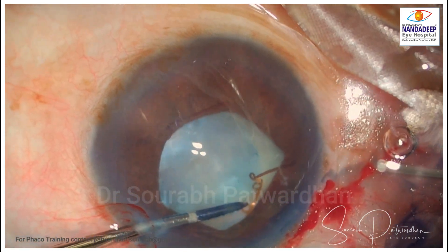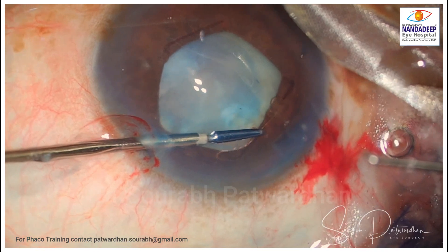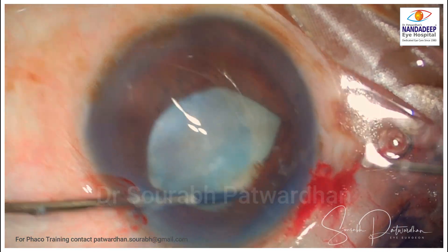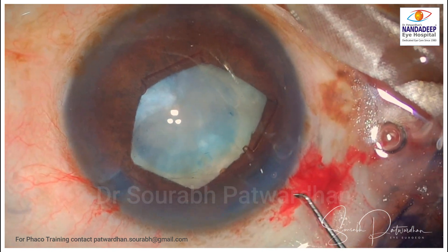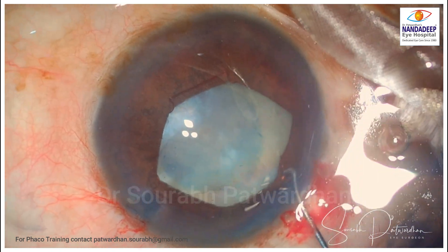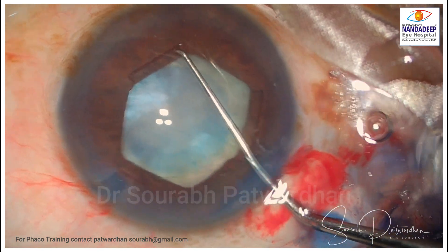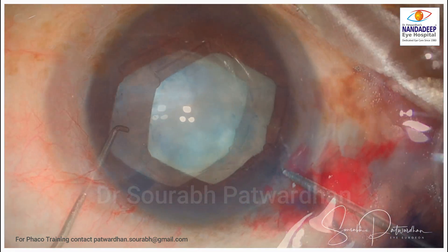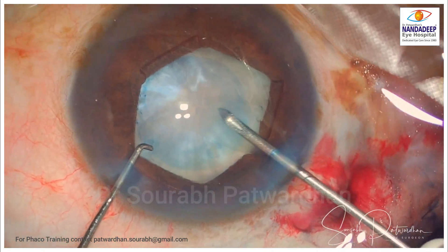You can do stretch pupilloplasty if it is too small or too rigid, but I could get away without it in this case. This ring expands the pupil to around 5.5 mm, but most importantly it retains the iris back, so during the FECO procedure you do not damage the iris.